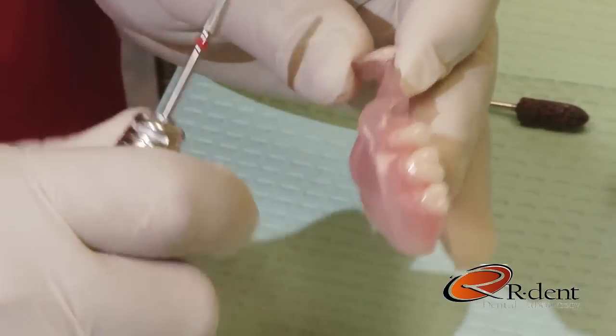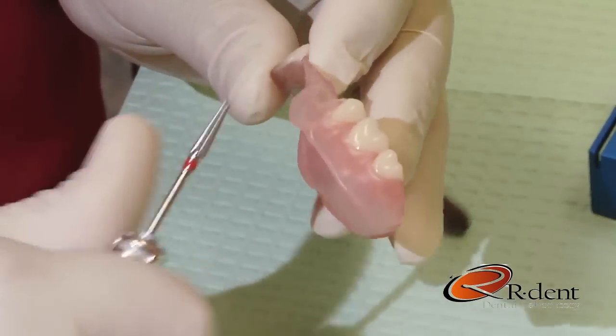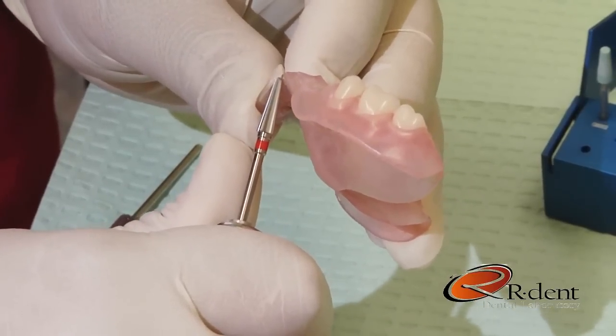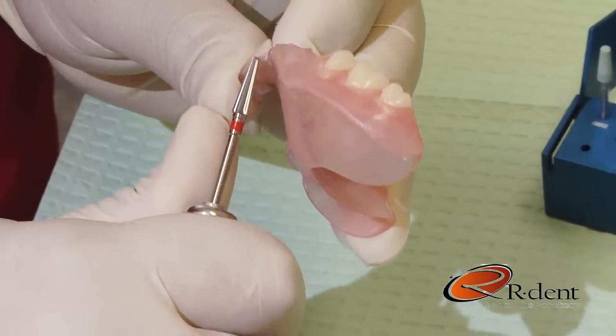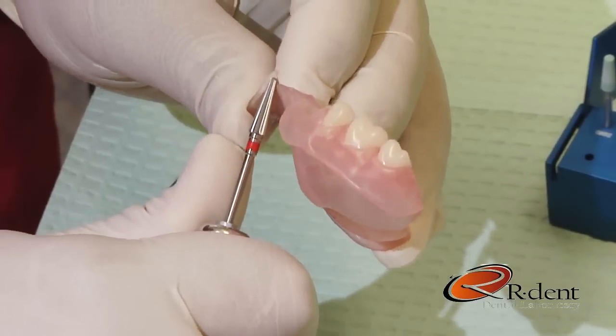When reducing the retention by relieving the mesial and distal undercuts of anterior teeth, I like to use the fine cutter and remove material slowly to assure not to create any food traps.